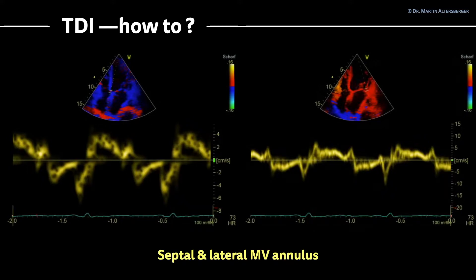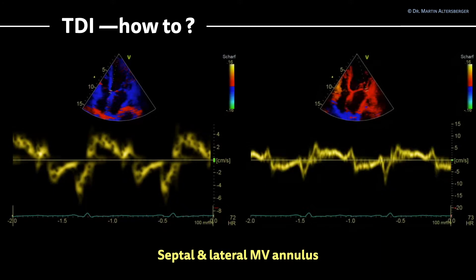You have two positions where you place the pulsed wave Doppler for TDI: the septal and the lateral mitral valve annulus. On the left-hand side you see the septal mitral valve annulus — there are two waves downwards, the E prime and the A prime, while the movement towards the apex is the S prime. We focus on the E prime. At the septal annulus, the E prime is the smaller wave, below 6 to 7 cm/s. At the lateral mitral valve annulus, the E prime is also clearly reduced, not above 10 cm/s — indicating reduced TDI at both annular positions.